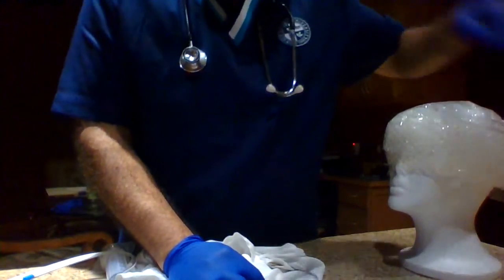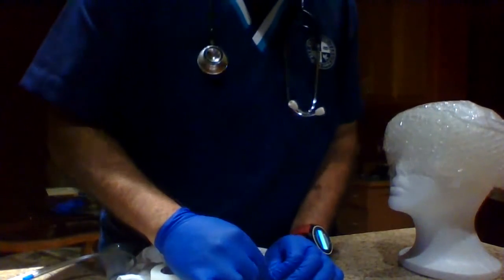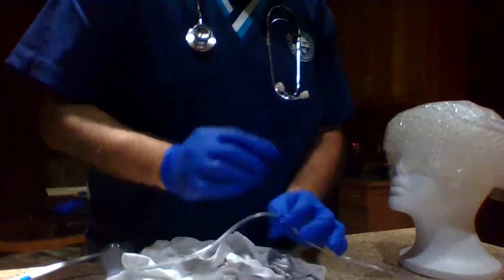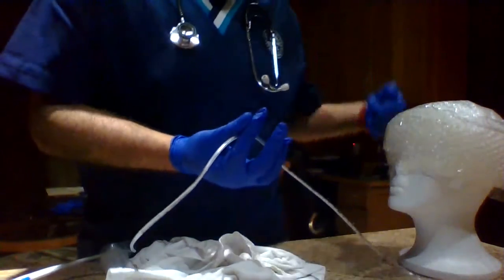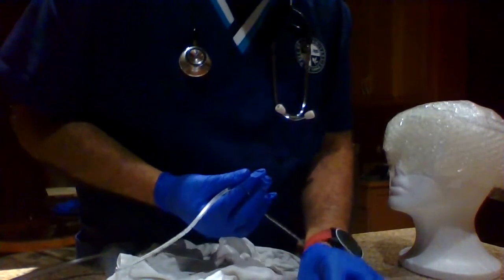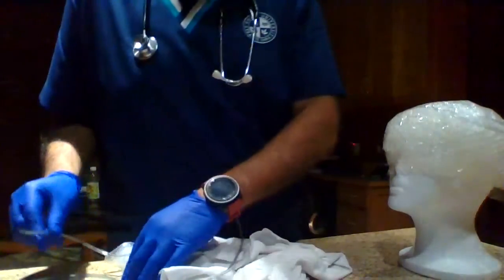What we're going to do is get a piece of tape and put it up here. This is our indicator of do not go deeper than that, because that's basically where we want this tube to be. So now we're going to lubricate 4 inches.